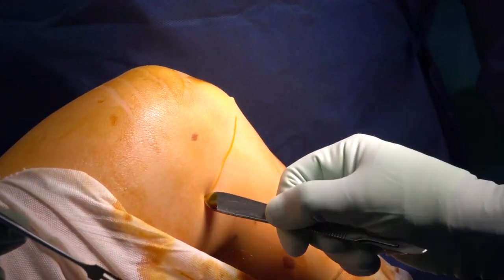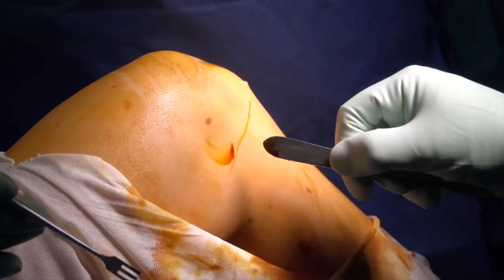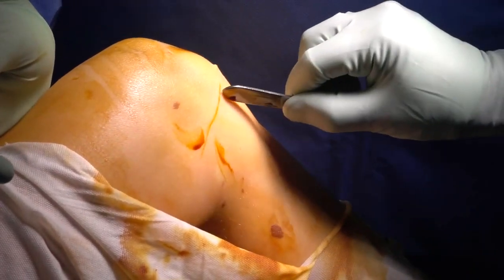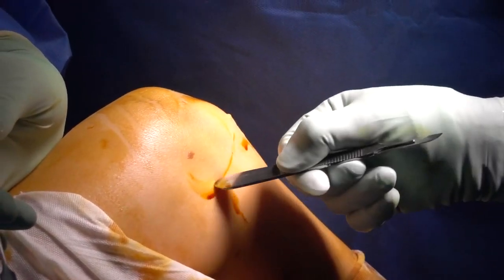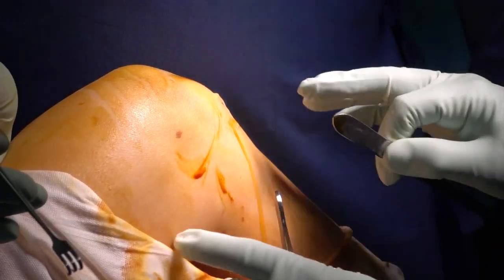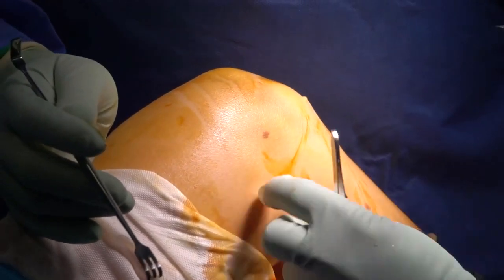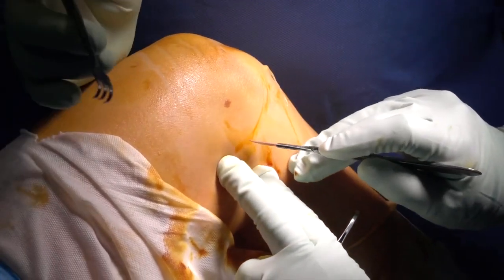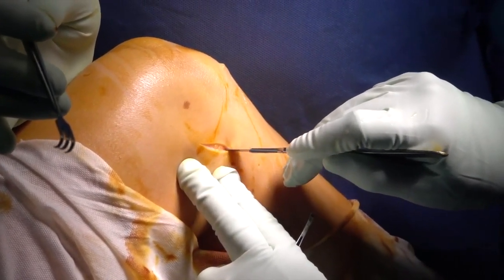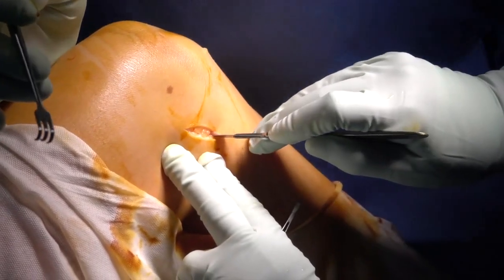The surface anatomy is marked to help orientate the incision. The joint line is traced, as well as the femoral condyle and anterior and posterior tibial borders. The posterior medial aspect of the joint is palpated. A 3 to 4 cm incision is made 1/3 above and 2/3 below the joint line.